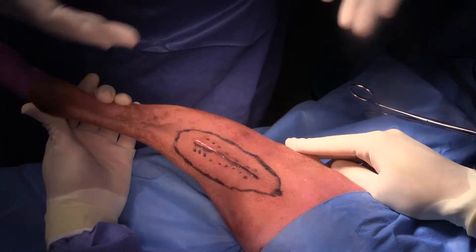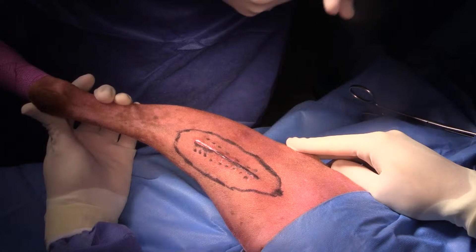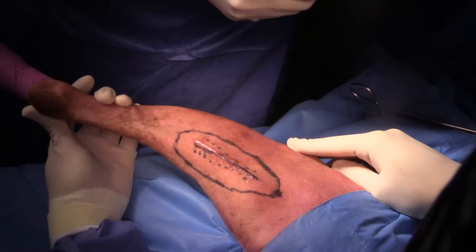We're removing the whole scar as if this was a de novo tumor, and also going in and removing that mass that's between the semimembranosus and the semitendinosus muscles.